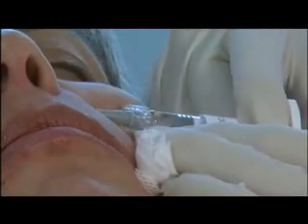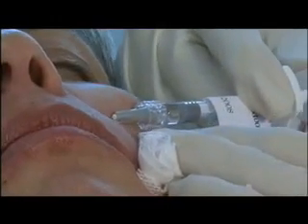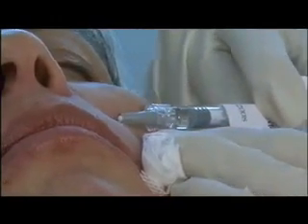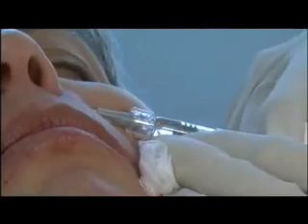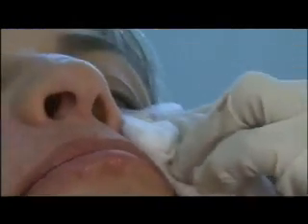In certain areas, such as the upper nasolabial fold, several backtracking lines are performed through the same entry point. This is the fan technique.